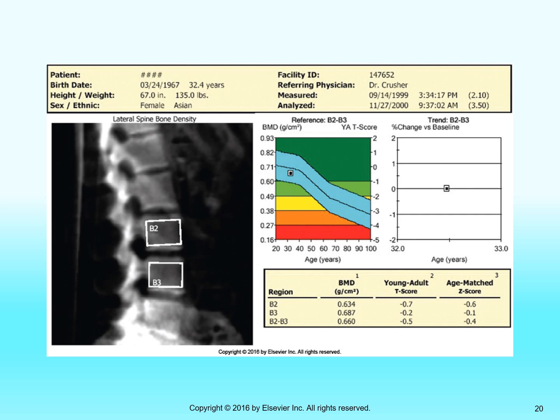So this is a typical bone densitometry report. Again, they call this a high resolution image. It looks a little blurry to me, but whatever. The image is not the point of the exam. The point of the exam is the chart and the data over here.